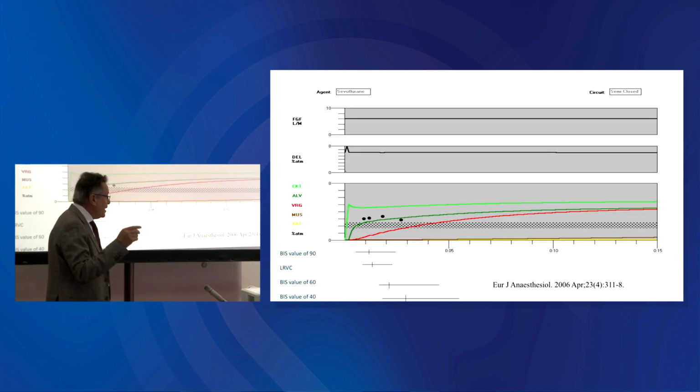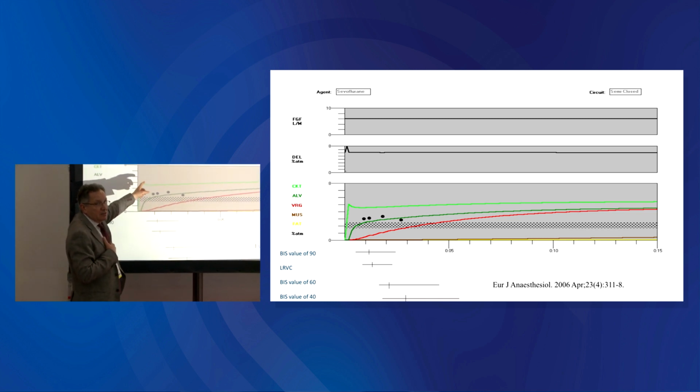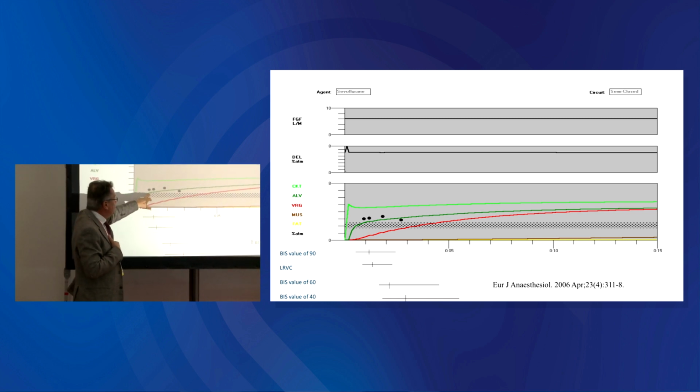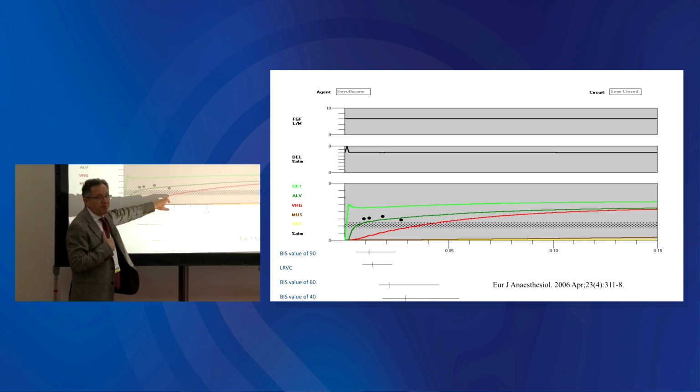And if you actually replicate what we did, this in green is the inspired concentration of sevoflurane. This is the end tidal. The black points are measured. And this is the predicted brain concentration of sevoflurane.